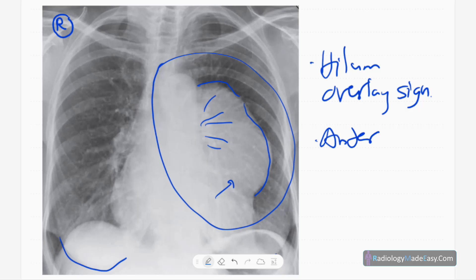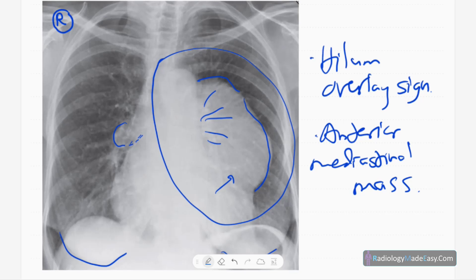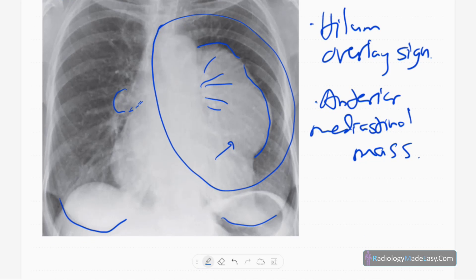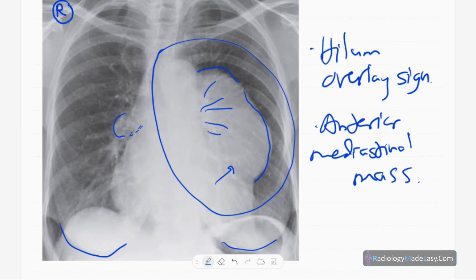You can clearly see the hilum overlay sign is positive and the heart border is obscured, confirming an anterior mediastinal mass. You can also see another small mass in the right hilar region — hilar prominence is noted there as well. There are no destructions or prominence in the right paratracheal region.